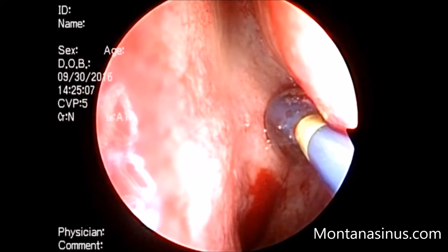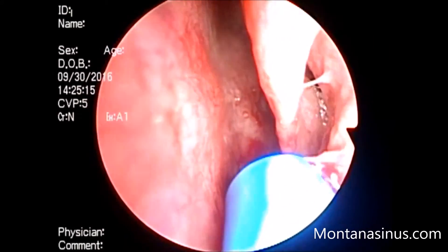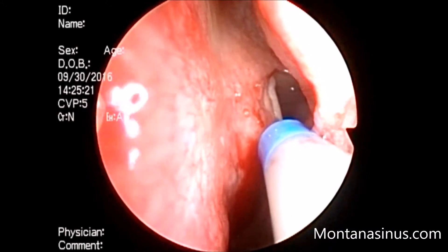The balloon is then fed over the guide wire and inflated. The sphenoid sinus is now seen to have a clear opening.